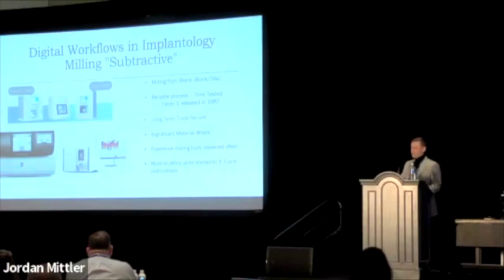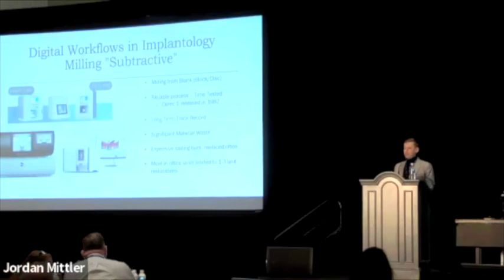There is significant material waste, right, from what's cut down or what's left in your disc or block. And not only is it cost prohibitive for many people to get into milling, the machines themselves, there's also the burrs are pretty expensive and they have to be replaced very often. Now, for most offices, it does seem like a few people here have some of the larger mills.